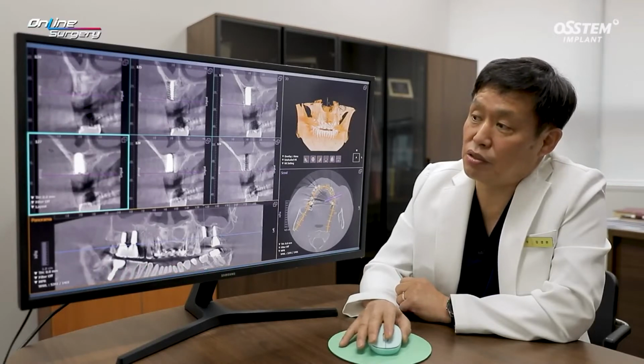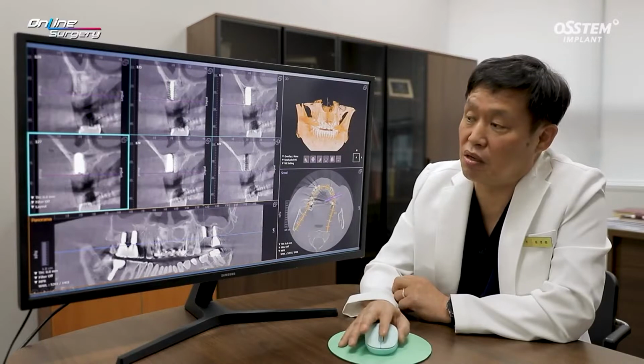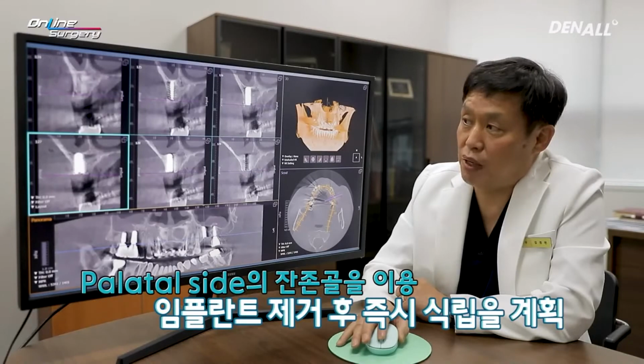In the case of this patient, the fractured implant itself was placed more buccally. Therefore, the bone is quite significant on the palatal side. Therefore, I thought I would be able to place the implant immediately. I plan to place a new implant right after implant removal.